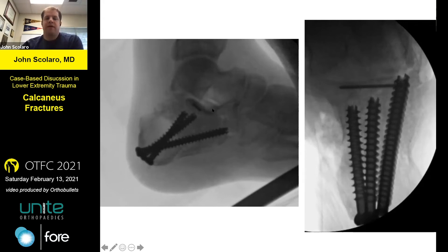There's a sequence of events in terms of getting the screw position, holding with K-wires, and transitioning to cannulated screws. I used three cannulated screws. The anterior facet on the lateral side is the longest area, so you want to make sure on the Harris heel view that your long screw is heading lateral. One thing the percutaneous technique doesn't do is allow you to dial in any lateral wall blowout.